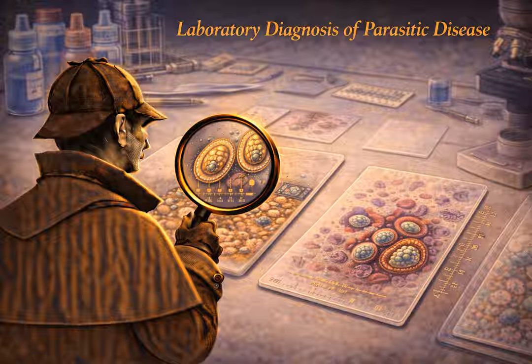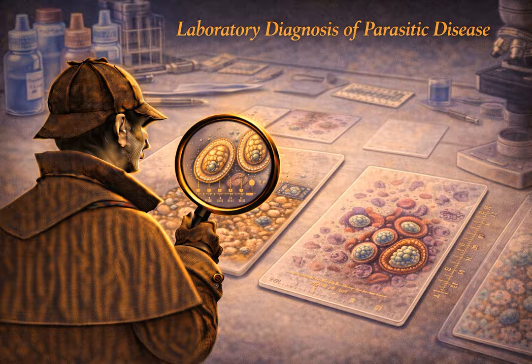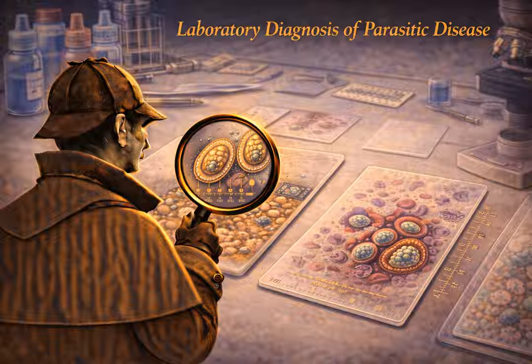You need to order the cellophane tape test, which everyone just calls the Scotch tape test. How exactly does that work clinically? It is absolute low-tech genius. You take a piece of standard clear cellophane tape. It cannot be the frosted matte tape. It must be clear. You loop it over the end of a wooden tongue depressor with the sticky side facing out. And you firmly press it right against the perianal skin. The sticky tape lifts the eggs right off the skin. Then you just unroll the tape, stick it flat onto a glass microscope slide, and look at it directly.